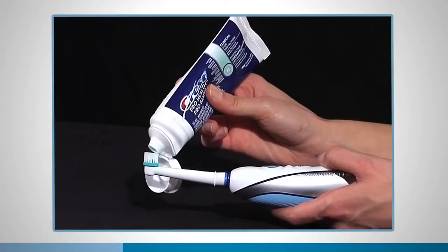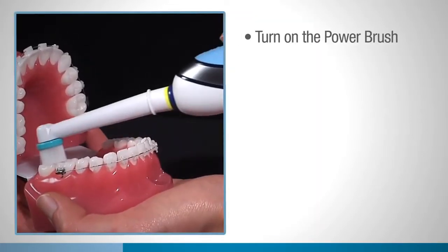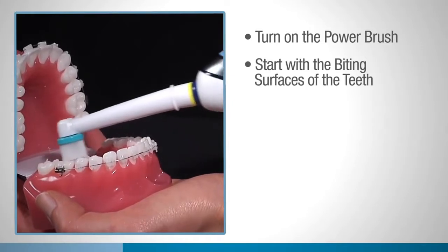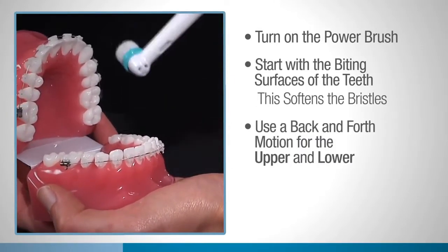Add a pea-sized amount of paste to the bristles. Unlike non-powered toothbrushes, an electric toothbrush does the cleaning movement for you, so you just need to guide it along the right spots. Turn on the power brush and start with the biting surfaces of the teeth. This will soften the bristles. Use a back and forth motion for the upper and the lower.